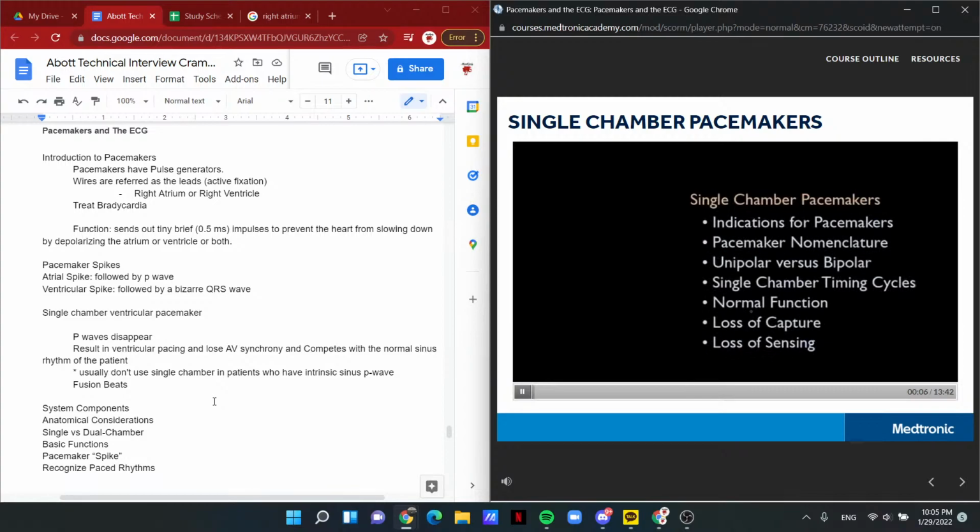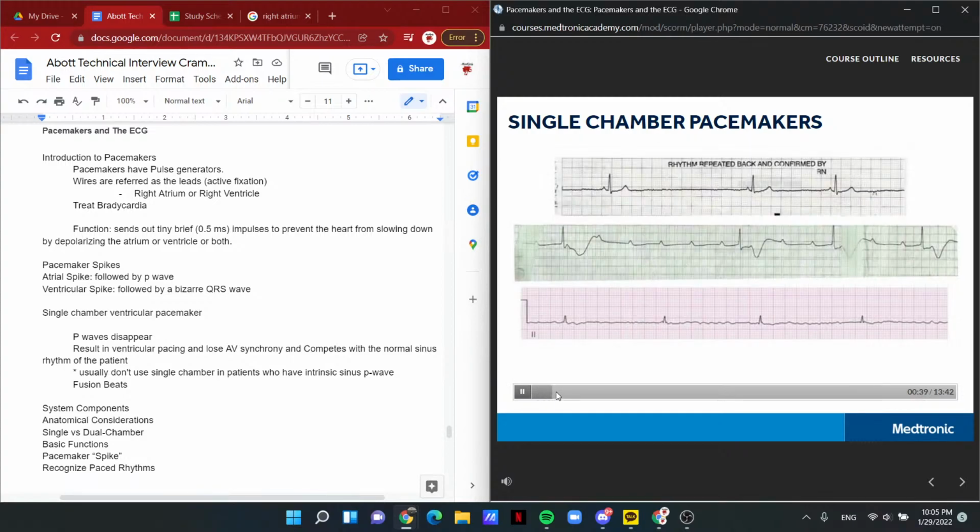In this video, we're going to talk about single-chamber pacemaker systems. I'll discuss the indications for pacemakers, and I'll teach you the nomenclature that we use to describe different pacemakers. Single-chamber pacemakers are used to treat symptomatic bradyarrhythmias.